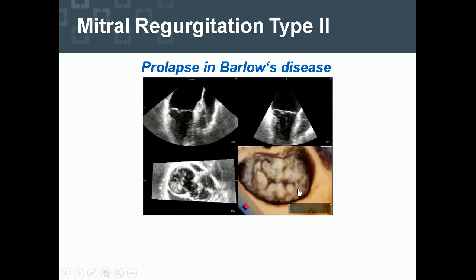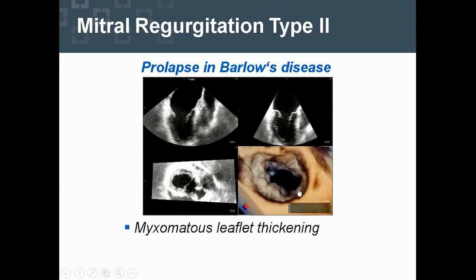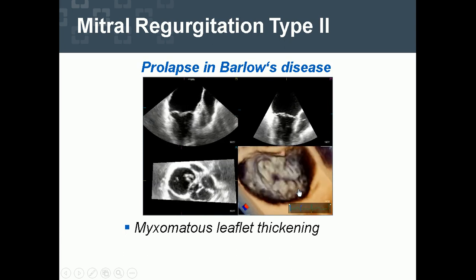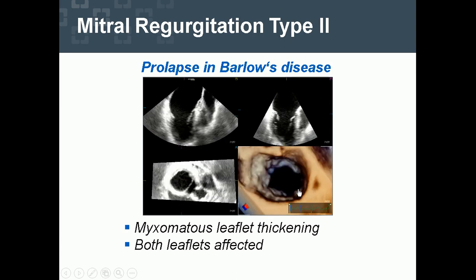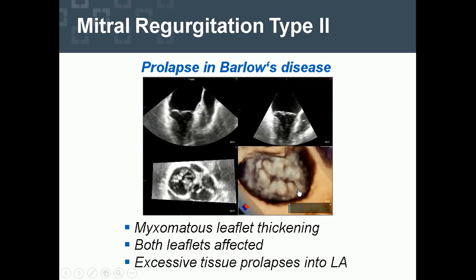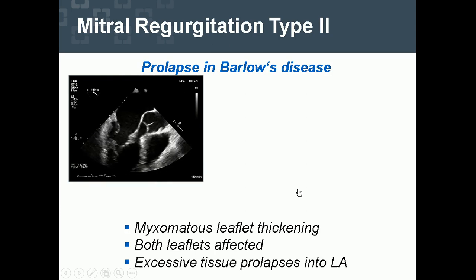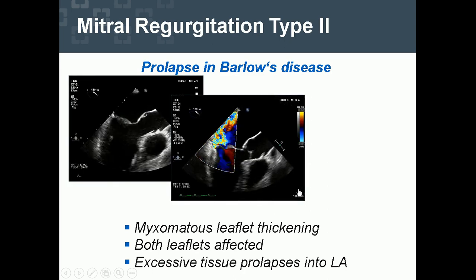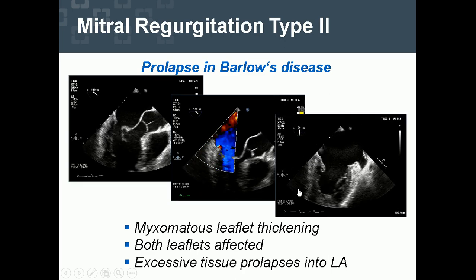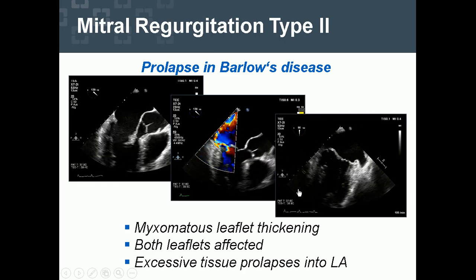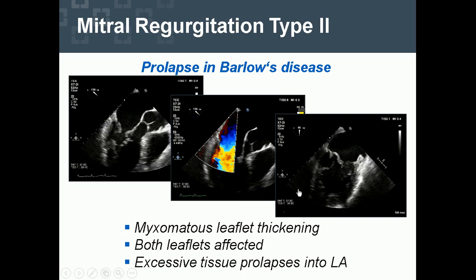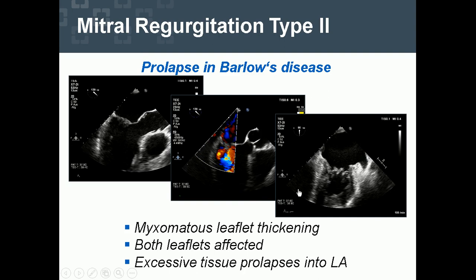Mitral regurgitation in Barlow's disease is due to myxomatous degeneration of the leaflets, nicely shown by leaflet thickening. Both leaflets are usually affected, and excessive tissue prolapses into the left atrium. On 2D echo, more than one segment is involved and we have eccentric jets. The thickening of segments such as A2 and P3 can be clearly discerned.